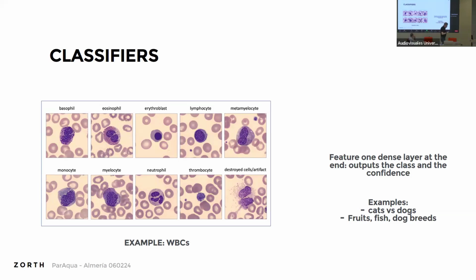And in oncology, for example, you need to make the slides. And the reason is that you're looking at some abnormals, and you're going to need to scan a lot of slides because, for example, there are very few basophils in blood.